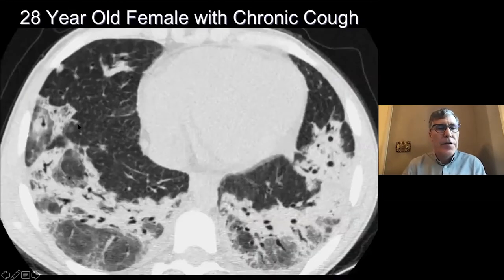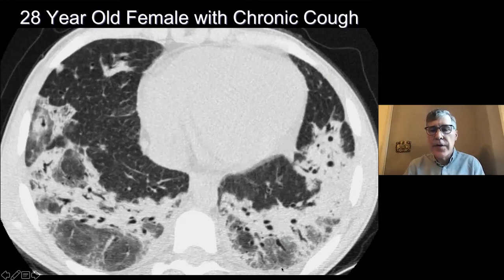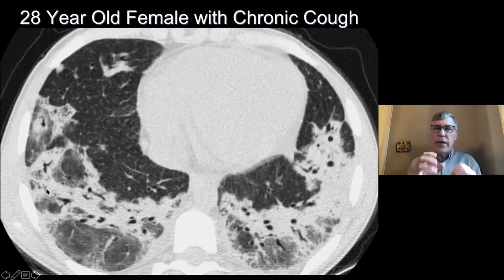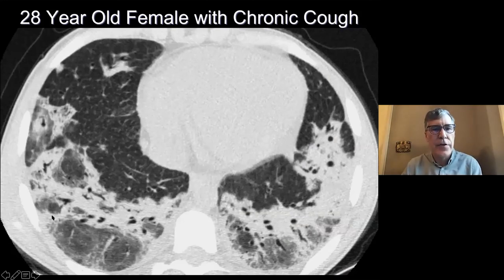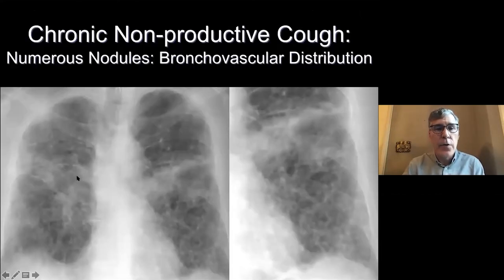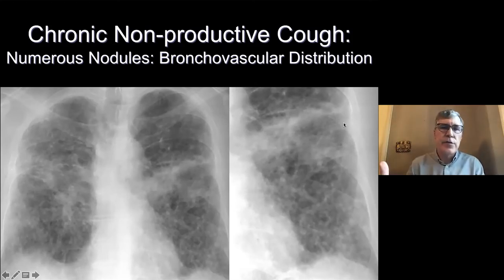This patient with cryptogenic organizing pneumonia shows consolidation but also has irregular visceral pleura, traction bronchiectasis, and architectural distortion. Architectural distortion is the displacement of the normal anatomy of vessels and bronchi — they get distorted and pulled by that retraction. This tells you it's chronic and that fibrosis or scarring is present. Another patient with sarcoid shows a bronchovascular distribution with nodules, but you can also see retraction and architectural distortion even on plain film — that indicates stage four sarcoid with evidence of fibrosis.